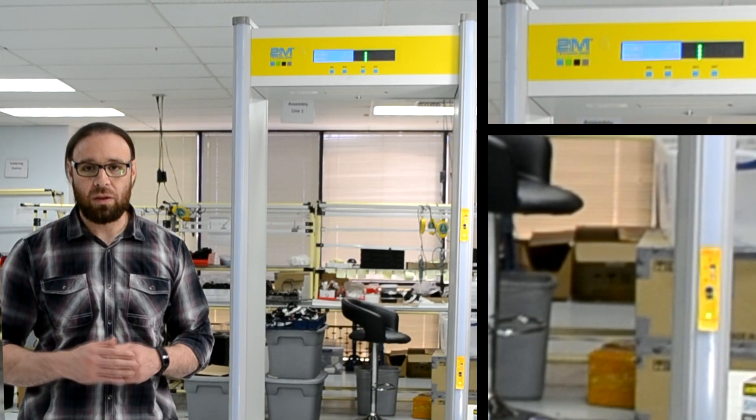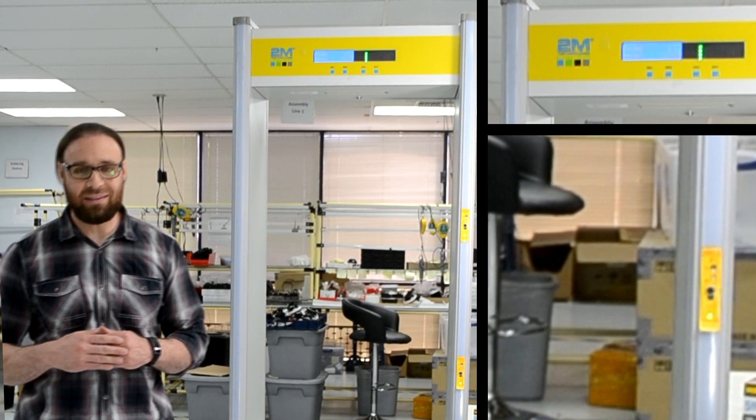If your temperature is normal, the machine will have a voice prompt and show a green LED light, as I'm going to demo right here.